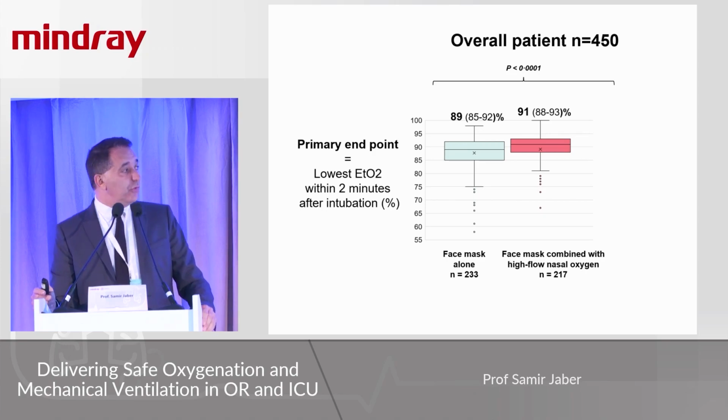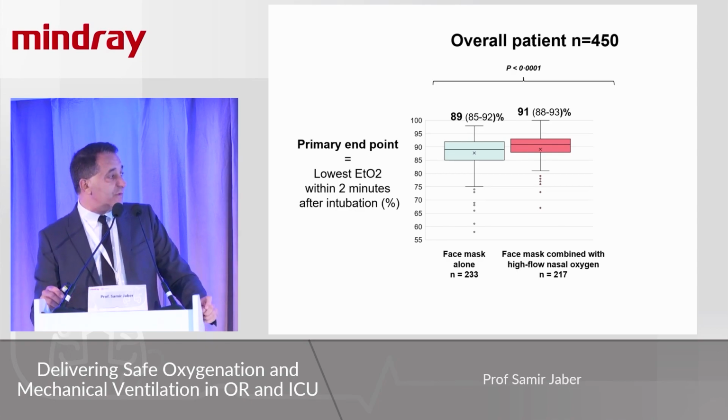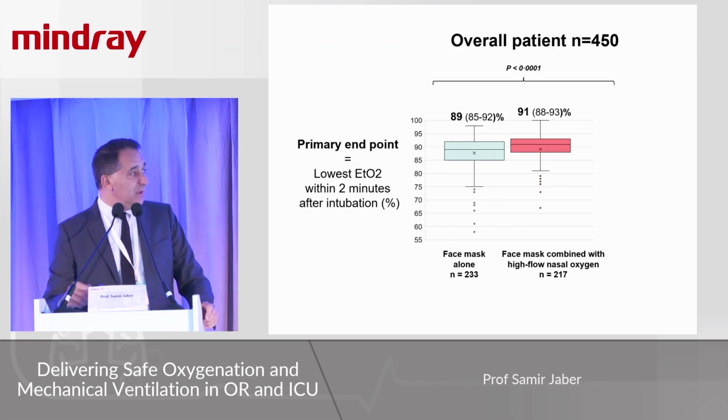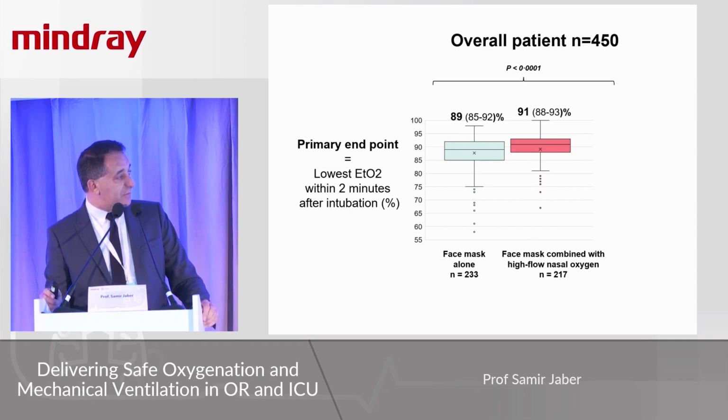The results are the following. 450 patients have been included, all consecutive, and the primary endpoint, which was the lowest end-tidal O2 within the 2 minutes after intubation. As you can see here, we have significantly lower in the standard group in comparison to the new one. As you see here, the median value and the mean value.